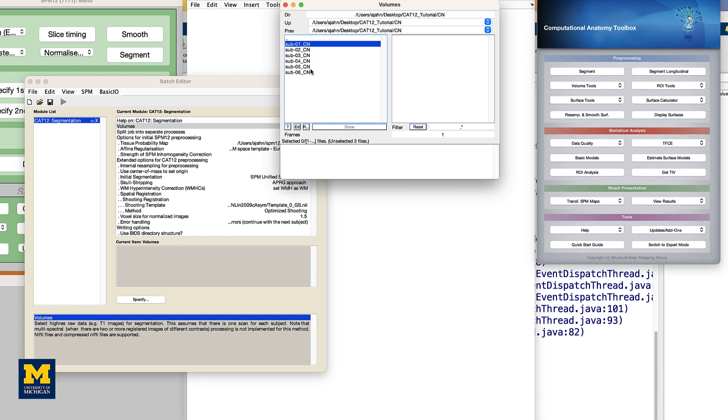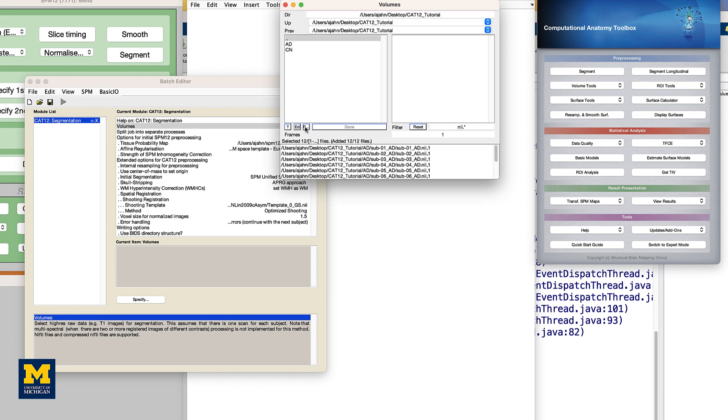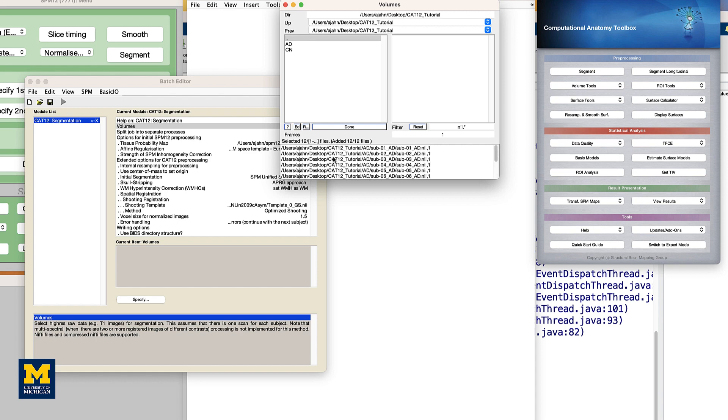Go back to the directory containing both the AD and CN folders, and then in the filter field, type NII. Click the REC or recursive button over here, which will recursively locate all files that end in .NII. Then click the Done button.